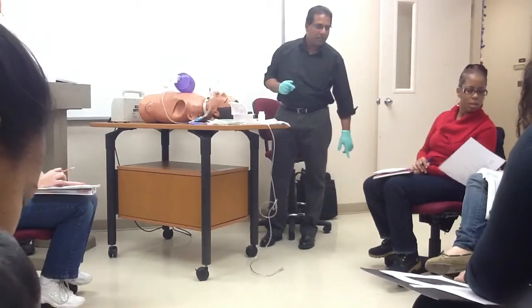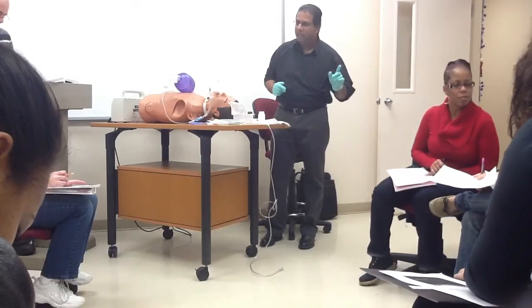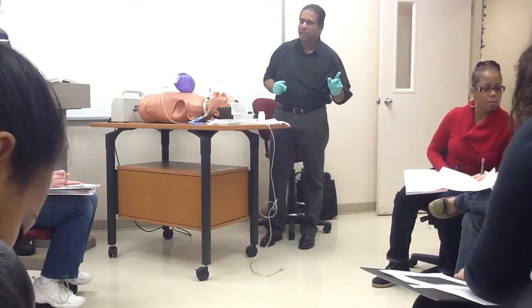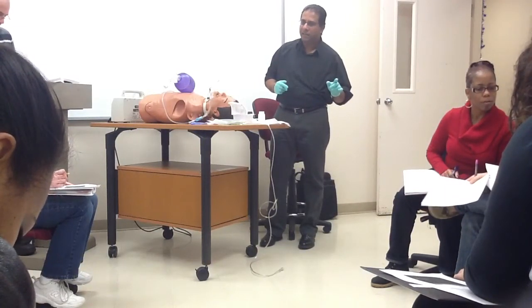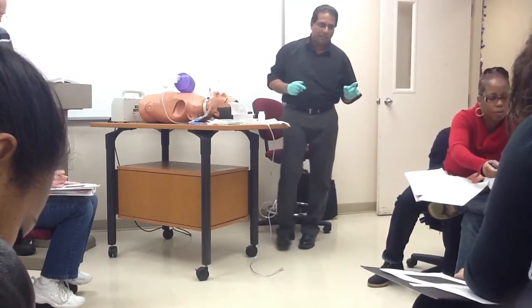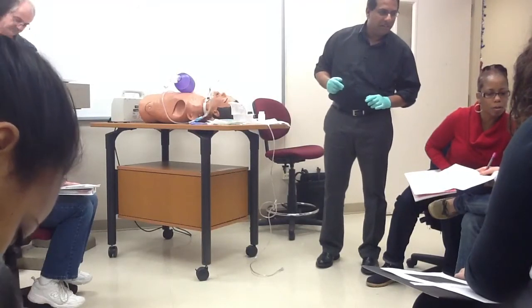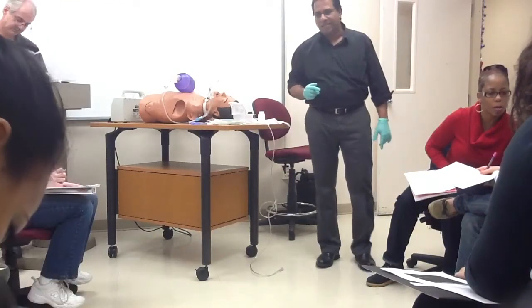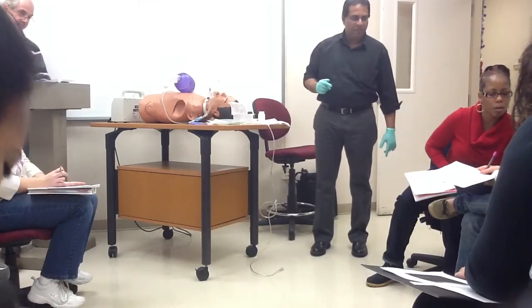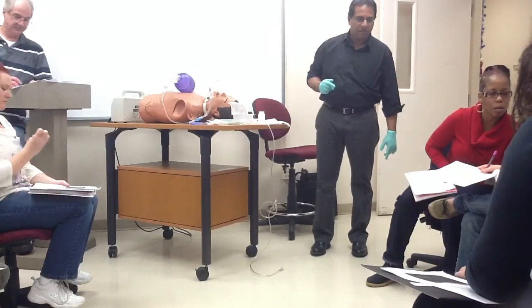Determine the size of the suction catheter to use. The outer diameter of the suction catheter should not exceed 1/2 the size of the inner diameter of the airway, because the airway is usually measured in millimeters, and suction catheters are usually measured in even number French size. A conversion is necessary. The following is the formula.